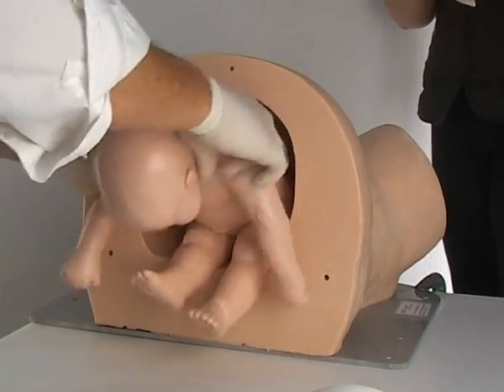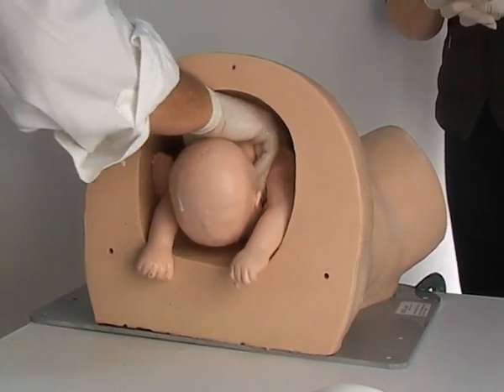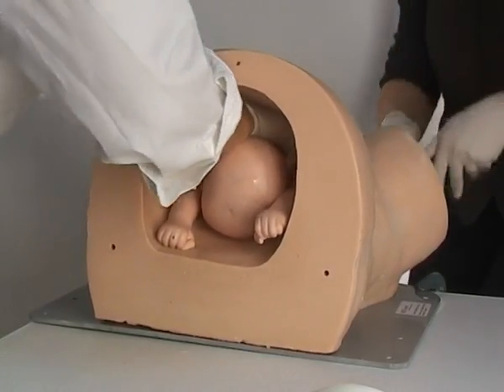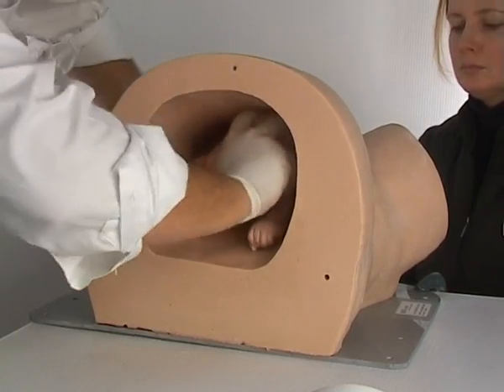In this scene, you can see a typical scenario with Sophie and her mum. There are two people using the model — one is simulating the birth, while the clinician at the other end can practice the various manoeuvres, skills, and techniques used in a breech birth.